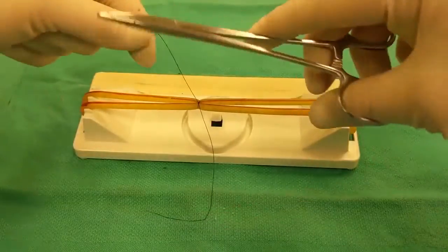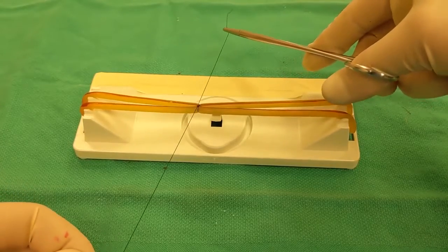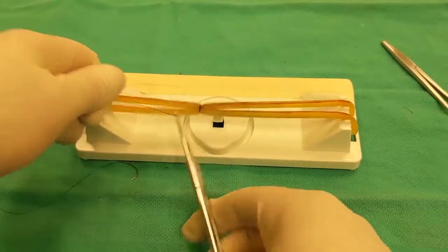Surgeon's throws are really better suited for closing tissues under tension, rather than a ligation. The friction knots covered later in this video provide a much greater ligature security than a surgeon's throw.